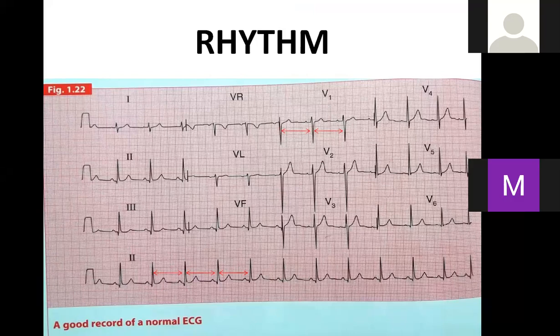And the arrhythmia will be of two types. One is the pattern, regular or irregular, and the other will be the rate arrhythmia. The patient may have tachyarrhythmia or bradyarrhythmia, and in the irregularity, the patient may have a regularly irregular rhythm or an irregularly irregular rhythm. You can find this by looking at long lead 2, and by looking at the P waves and the QRS complexes.